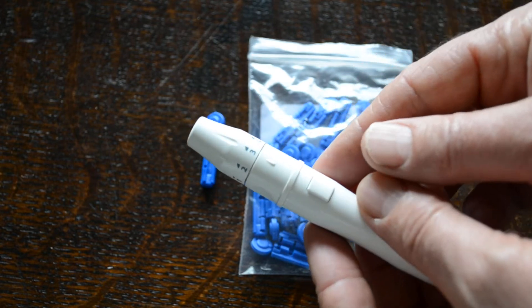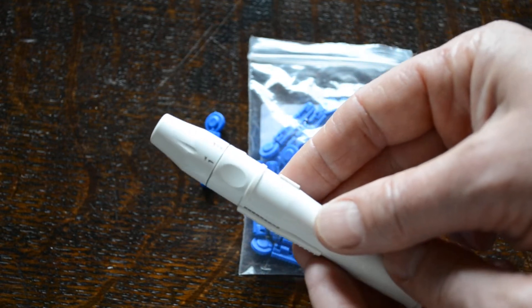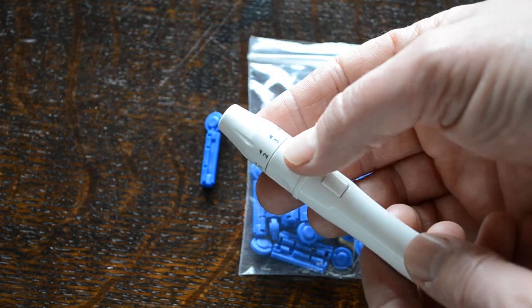For a sufficient blood sample, for most of these tests you're looking between one and six or seven microlitres of blood, so it's a matter of experimentation. We usually recommend when you first get the meter that you set it on the medium three setting.